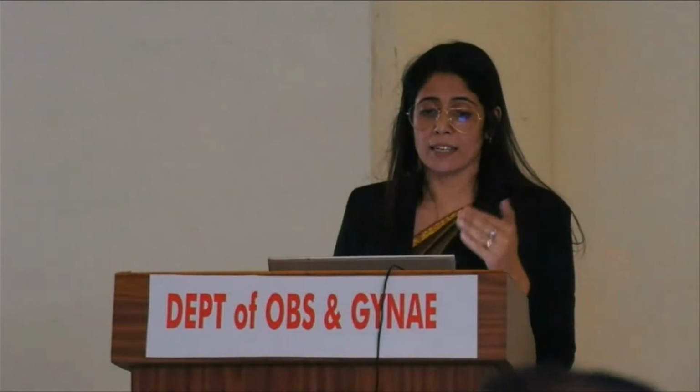So, this was a paper by Syngelaki where she has said that if you follow this checklist, there are certain anomalies which are always detectable in the 11 to 14 week scan, and these are acrania, exencephaly, ectopia cordis, anencephaly, holoprosencephaly, cystic hygromas, megacystis, gastroschisis, and limb-body wall complex, which I shall show in cases.